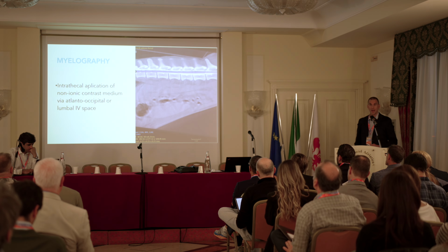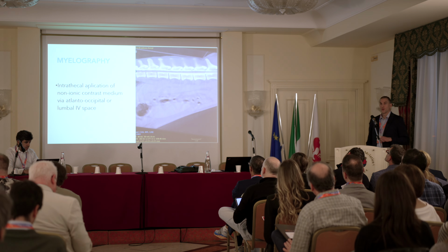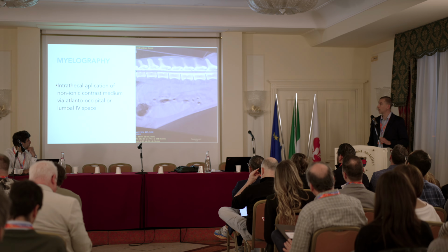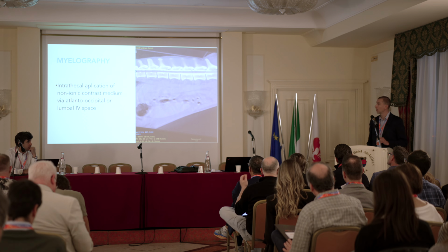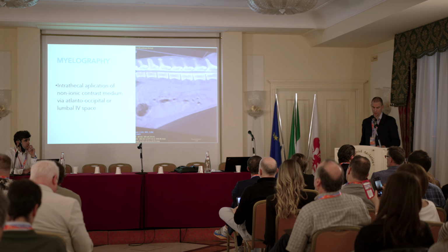So myelography is putting contrast medium into the spinal channel. So directly it's intrathecal application of non-ionic contrast medium. We can use two ways of application, so cranial and caudal. We will speak in the future about each application. There is a different approach than Filippo has.